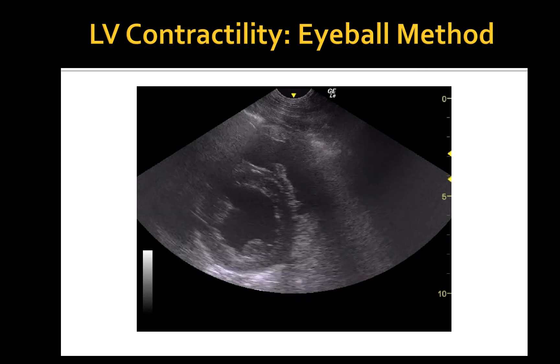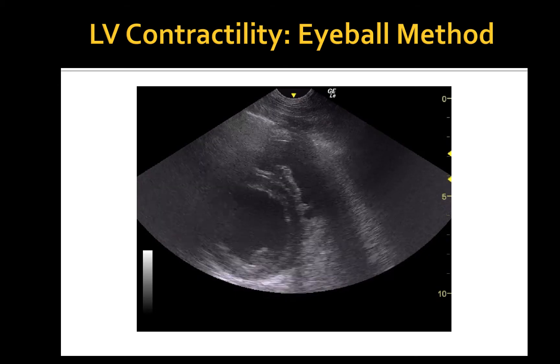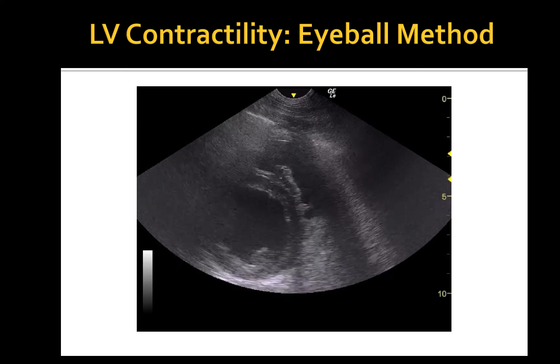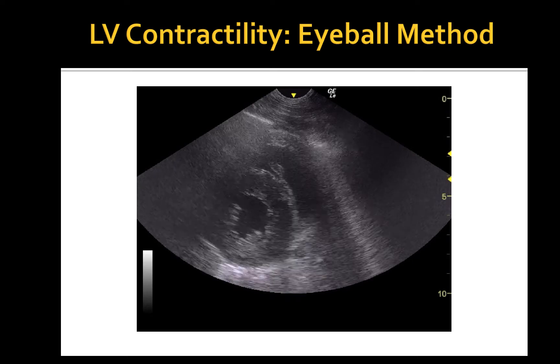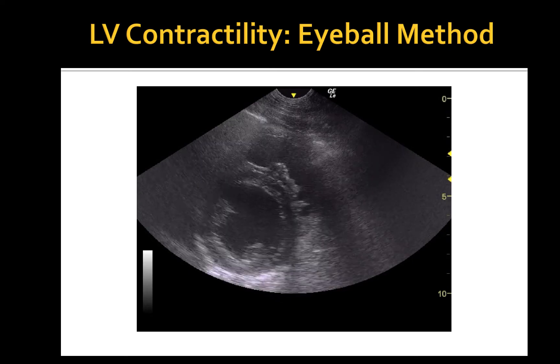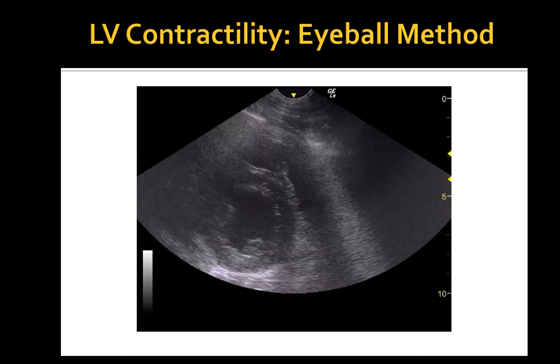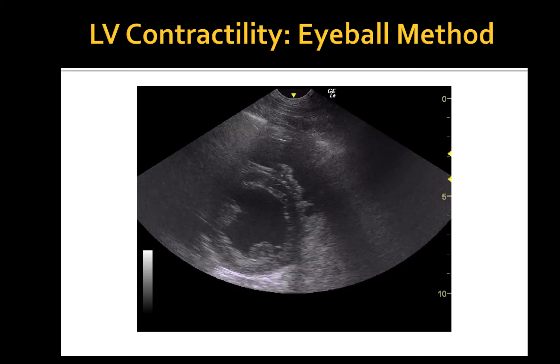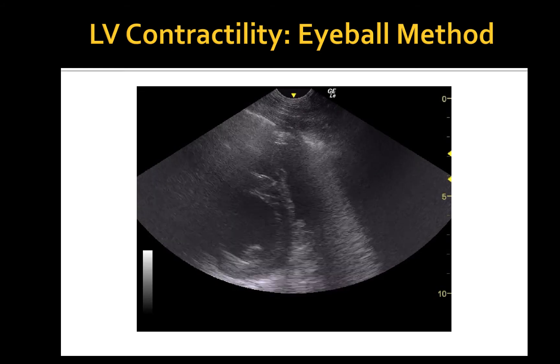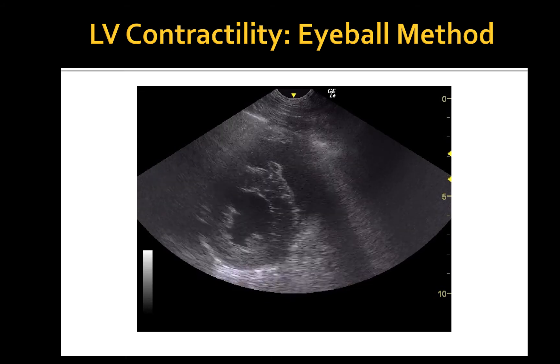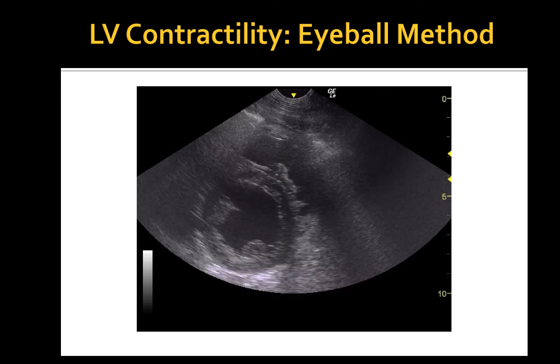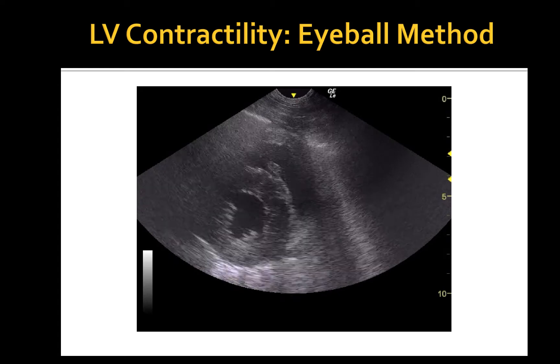This is a right parasternal short axis view obtained from the same dog as in the previous slide. Here you can appreciate two papillary muscles and the so-called mushroom view. The quality of the image and image acquisition is relatively good given that it was obtained by a non-cardiology ultrasound machine in a standing dog. Similar to the long axis view, you can appreciate good endocardial excursion and thickening of the interventricular septum as well as the free LV wall during systole, which is consistent with normal LV function.